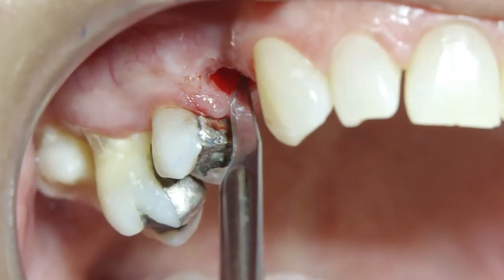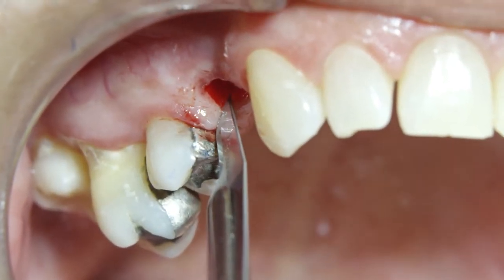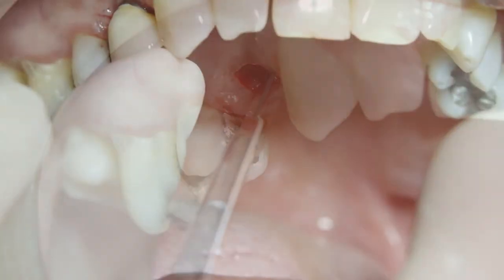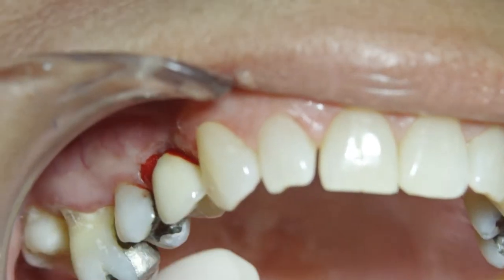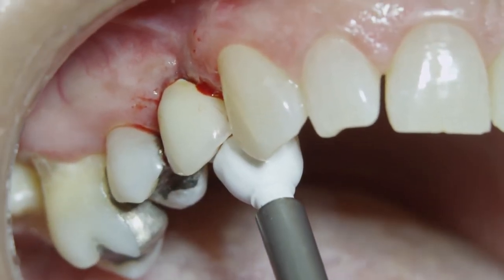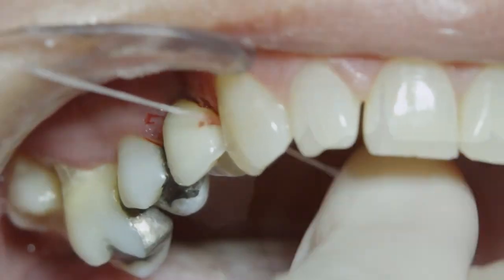Two relieving incisions are made interproximately in the sulcus to further facilitate the definitive seating of the IAC. The crown is then reinserted with finger pressure, tapped with a white plastic temporary abutment, and contacts are checked with dental floss.